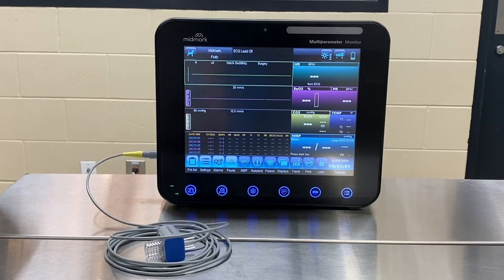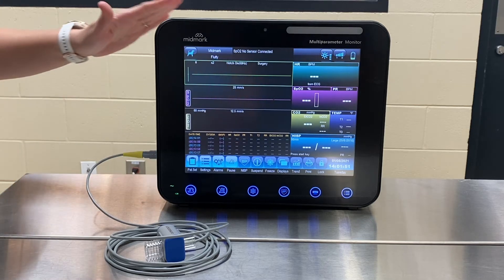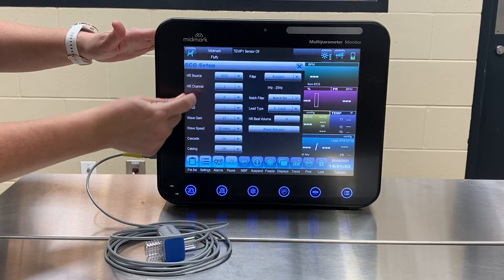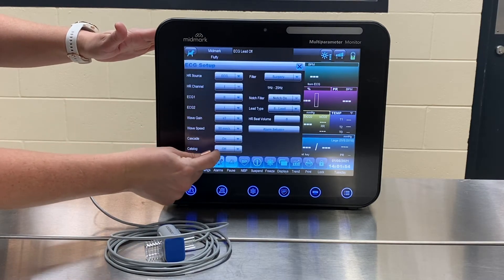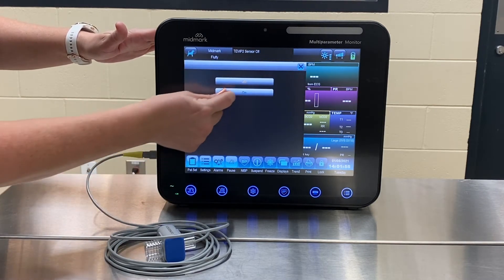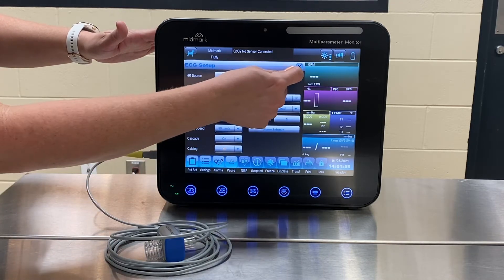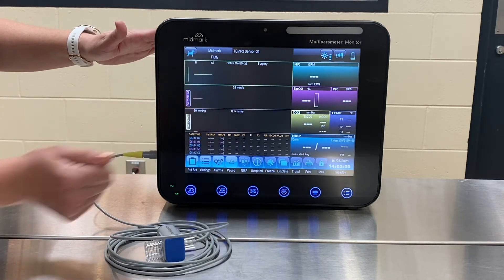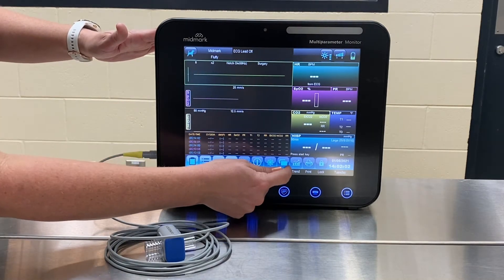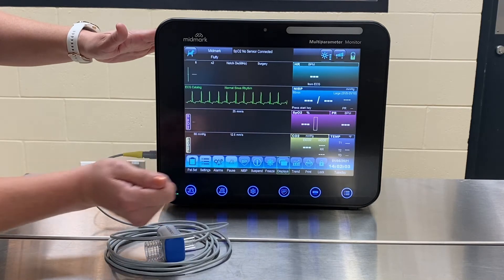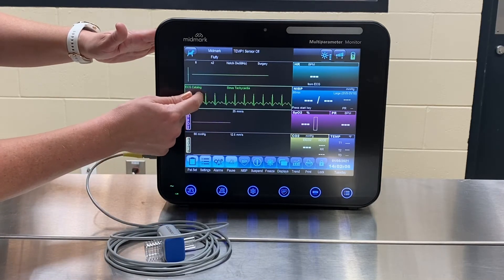The ECG library allows you to quickly scroll through 10 of the most common arrhythmias occurring in patients under anesthesia. To turn on the ECG library, press on the ECG waveform, find ECG catalog, and press On. Press X in the upper right to return to the main screen and select display modes to display the ECG catalog.